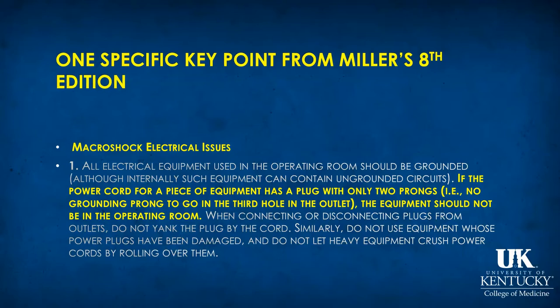And that is simply that you should handle the cord by the plug, and you should not use equipment whose power cords have been damaged, nor should you allow heavy equipment to crush power cords by rolling over them.